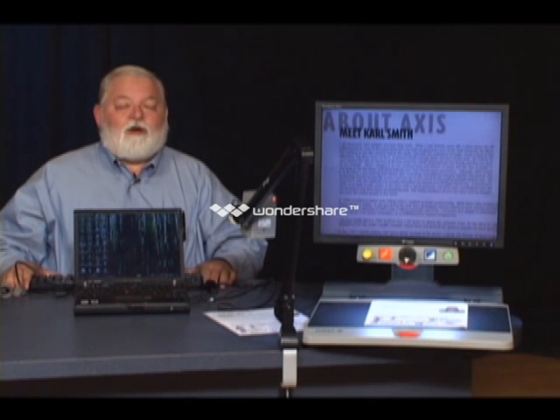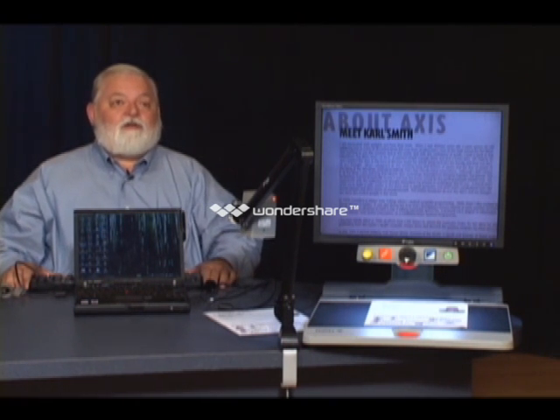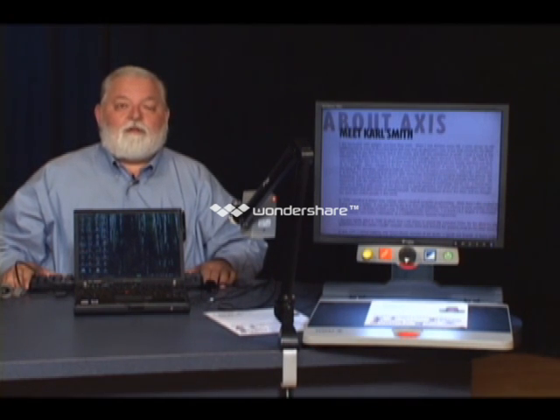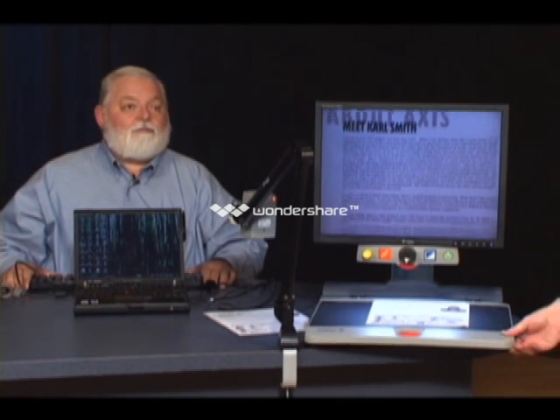So you may be surprised to find out that somebody doesn't want it as big as you might imagine they do. So all the units now that you find on the market typically start somewhere around 2 or 2.5 in size, because we found, again, that people just don't want them quite as large as that. Now this unit is a full color unit, which pretty much all the machines that are sold now are.